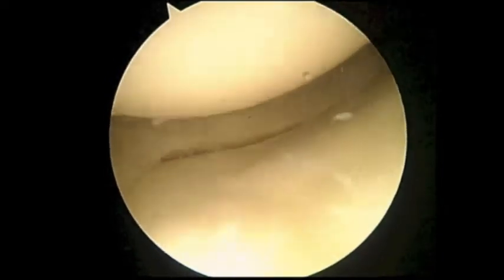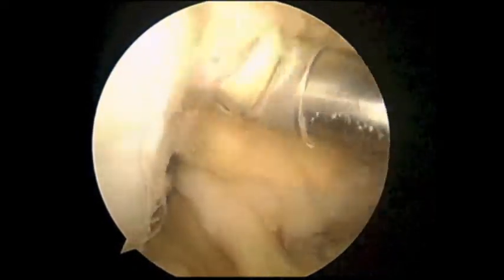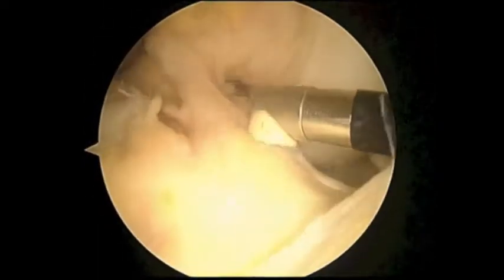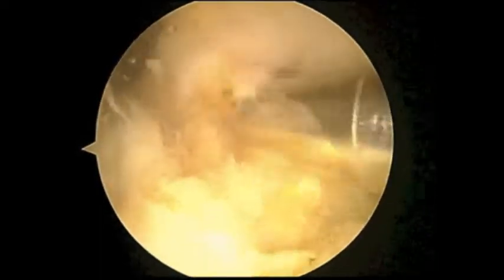We also look at the lateral meniscus, which is the meniscus on the outside of the knee, and the cartilage surface there. Now we're going to clean away the portion of the ACL that's torn, exposing the footprint where we want our new ACL reconstruction to attach and insert through. This is the attachment of the ACL on the shin bone called the tibia. We're going to remove this area as well and clean off this surface again to drill our tunnels in the correct positions in the knee.